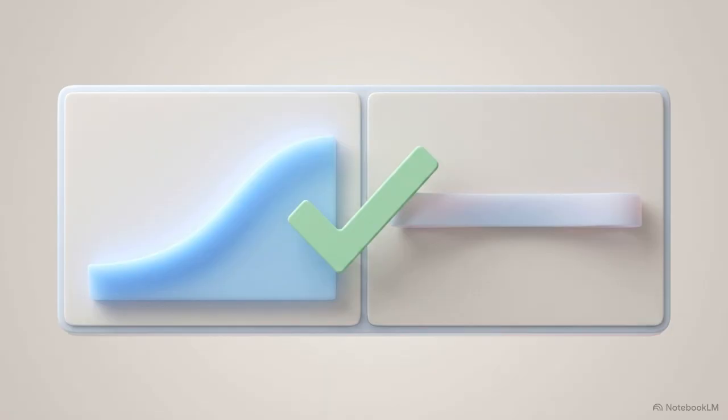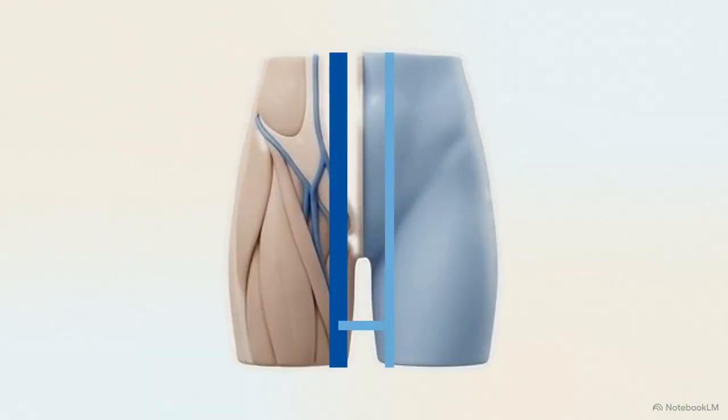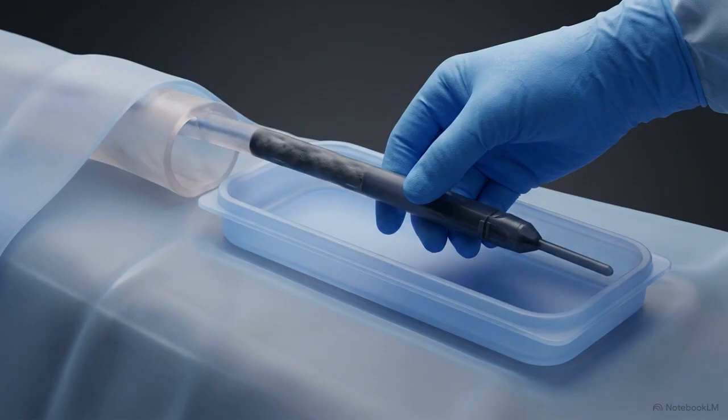That specific combination proves the flow is a compensatory bypass. Ultrasound is no longer sufficient. The immediate next step is CT or MR venography to locate the hidden pelvic obstruction. When extensive post-thrombotic deep vein obstruction is confirmed and the GSV is acting as an antegrade bypass, superficial ablation must be strictly avoided or deferred.